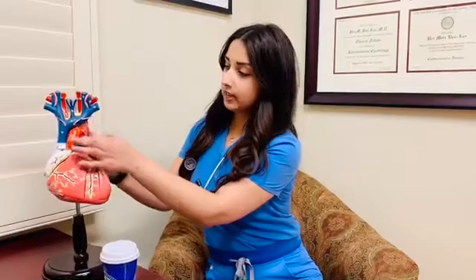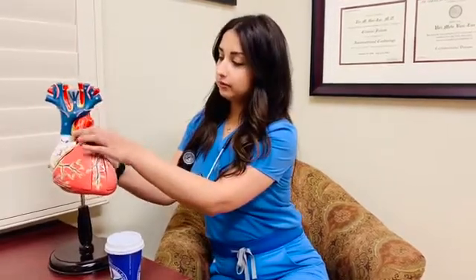Hi, so today we're going to be talking about transcatheter aortic valve replacement. So this is your heart, and right here is the aorta. And within the aorta, right before the aorta starts ascending, there's an aortic valve, and that's what we're going to be talking about. So, what is the aortic valve?